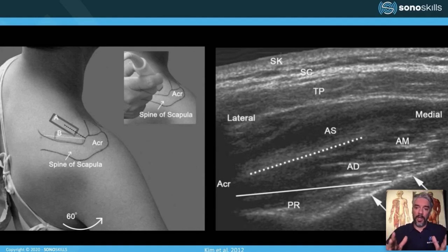And we know that the pennation angles can change with sarcopenia, with fatty infiltration, with atrophy, with tearing and ruptures of the supraspinatus muscle or tendon complex. I don't do that much with pennation angle measurements, so I'm not skilled enough in that. That's still for me to learn.